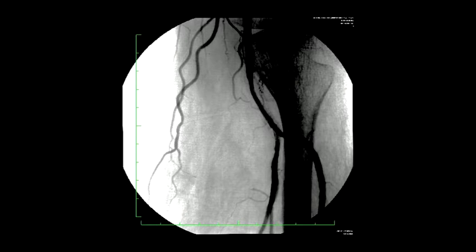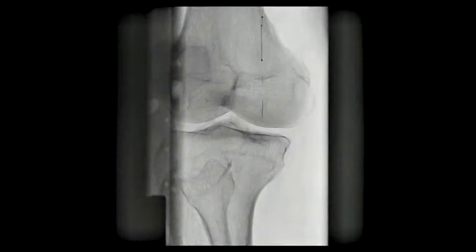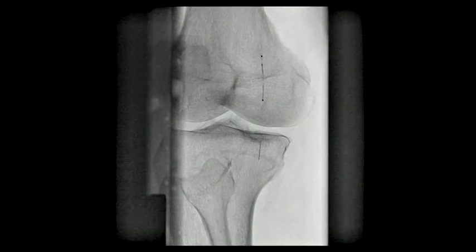And we put in thrombolytics. And a few days later, this is what we got. Territory that we've got to work across, you see the thrombus, and you think it is chronic, but it is some thrombus. The history suggests that the patient has had chronic problems. You can use rTPA, you can use urokinase, whatever you're comfortable with. Stage the procedure. Trying to do too much in these small vessels in one go can result in disasters. If we had persisted with angioplasties, thromboaspiration, this, that, and the other, we may never have saved that leg. Okay?